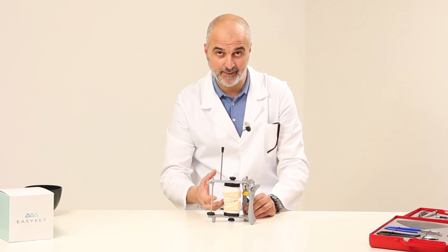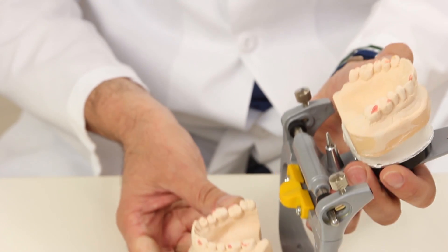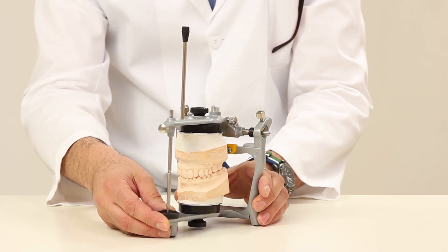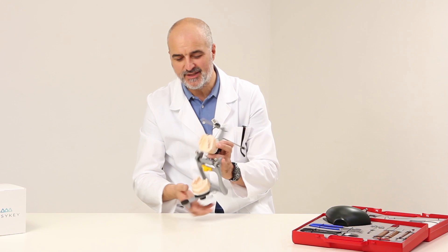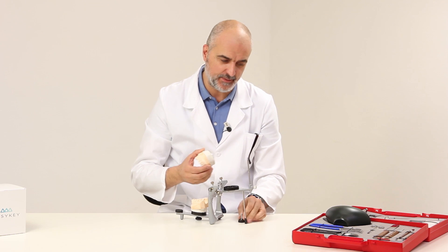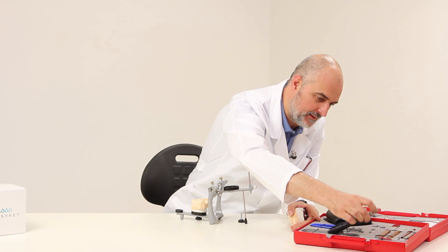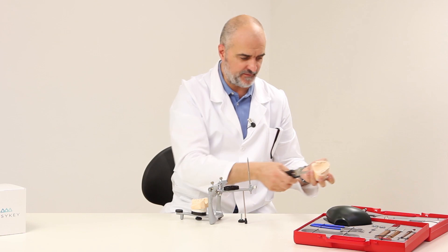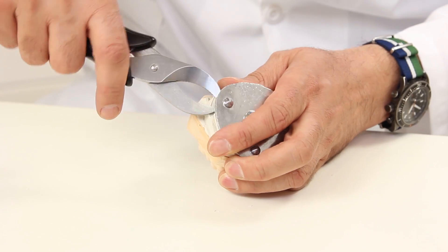Once this step is completed, we must wait for the plaster to dry, and then open the articulator and remove the wax using a steam cleaner. It is now possible to carry out the procedure required. Once the process is complete, we can recover the metal plates to reuse them by simply using the plaster pliers found in the case containing all the tools necessary to create fixed and mobile prostheses. We recover these by working between the plaster and the plate. Once thoroughly cleaned, they can be used again.